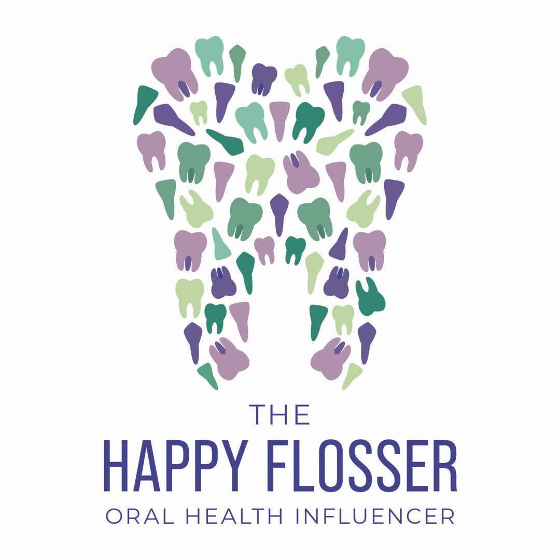And those conditions are usually benign, like I said. But then there are sometimes important exceptions to those, like chondrosarcoma, which can be slow growing and cause cortication, but is still malignant. And other exceptions are those punched out lesions. They're uncorticated, but they're well defined and they may prove to be fatal. Those are things like multiple myeloma and histiocytosis X.